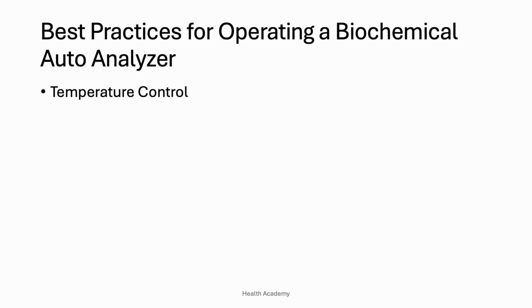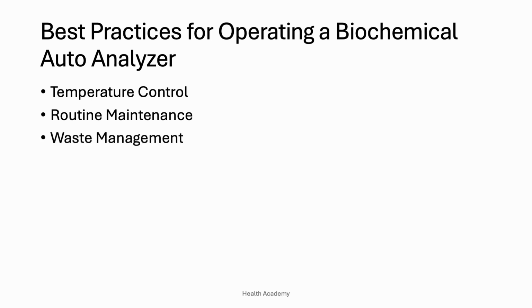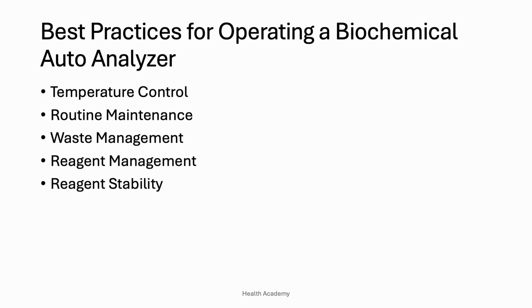Temperature control. Ensure room temperature is within the optimal range for analyzer operation. Routine maintenance. Conduct daily maintenance checks and maintain logs for weekly and monthly upkeep. Waste management. Regularly inspect the analyzer's waste disposal systems. Reagent management. Verify reagent levels for both loading and unloading procedures. Reagent stability. Keep track of the onboard stability of reagents within the analyzer. Quality control. Perform quality control and, if necessary, calibration to align with target values.